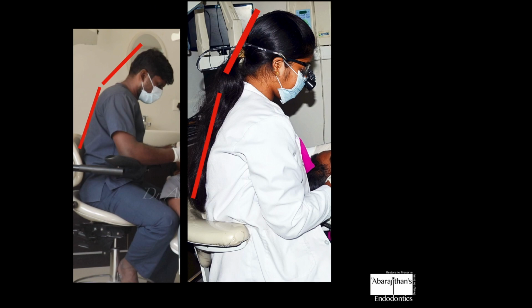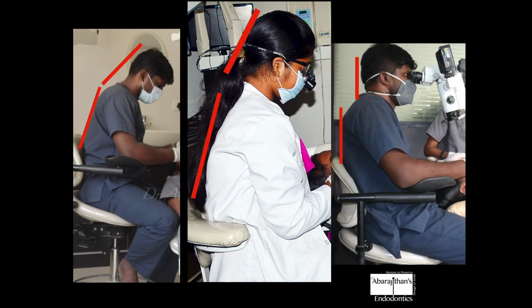So before we conclude, the take-home message is, though with basic ergonomics you can overcome the errors that you used to make in the earlier days, still there is some amount of bending of the neck that is happening when you work with the naked eye, which can be improved with loupes. So for people who are working with naked eye, it is always better to at least use loupes for your dentistry, and the best way is to use magnification with microscopes, where you get the top level of ergonomics.